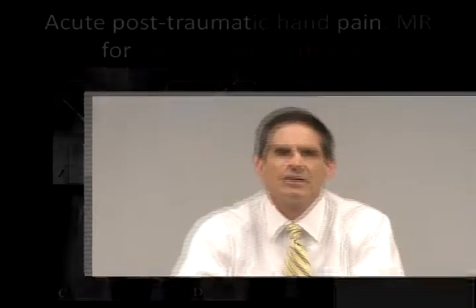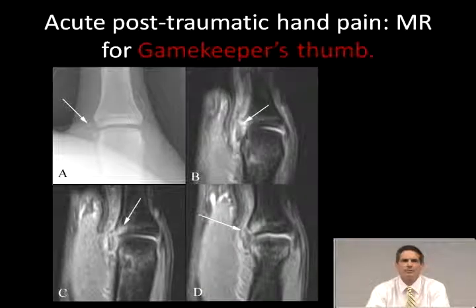And probably with any of these ulnar collateral ligament injuries, you might want to think about a hand surgeon or orthopedic surgeon, because failure to diagnose these can lead to disabling, debilitating, and painful laxity of that joint. And of course, that joint is used all the time for everything, so you don't want to miss a lesion of that. Here's a picture of that.